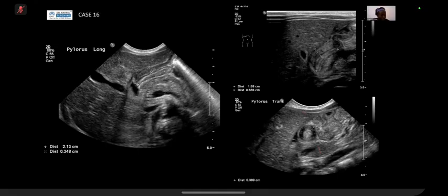Yeah, perfect. So that's exactly the case. So this is the case of hypertrophic pyloric stenosis. So here we've got the pylorus, we've got the stomach, which you can't see fully on this image. This is pancreas, and then this is liver. And the pylorus normally sits between the pancreas and the liver, so I use that as my landmark for when I'm looking for them on ultrasound.